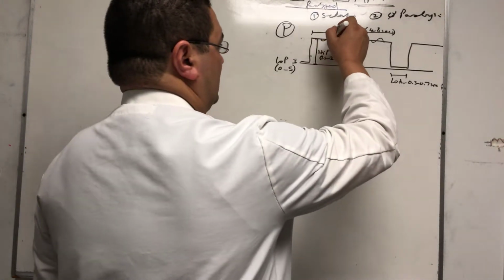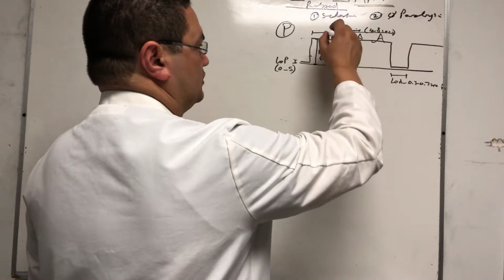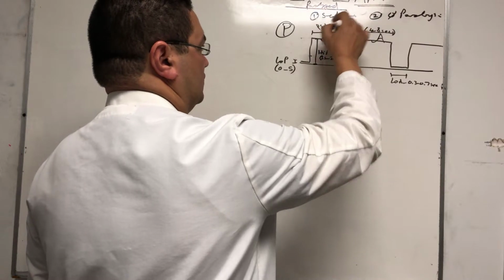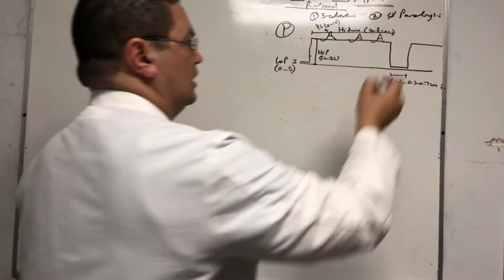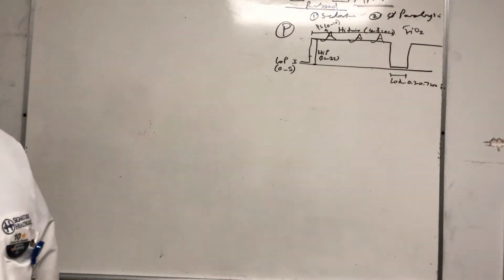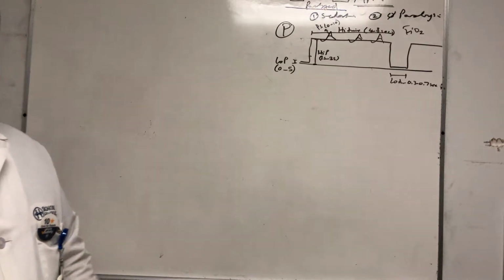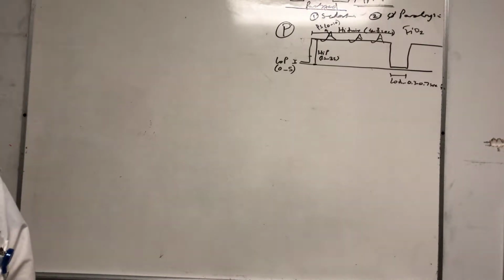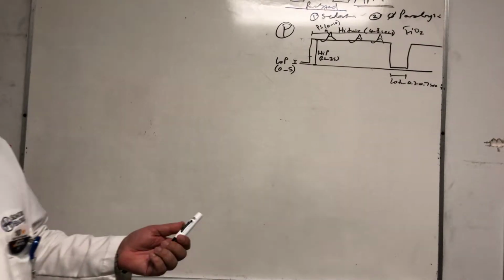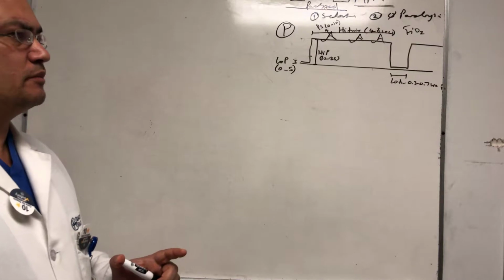In addition to that, you can actually do pressure support. Each one of those small breaths, you can support with a pressure support breath, which is 0 to 10 usually. That's how we start. And then you add the FiO2 to the mix, and that means you have 6 set parameters. Remember yesterday we said you have 4 set parameters for volume control, 5 set parameters for pressure control and SIMV, and 6 set parameters for APRV and bi-level. So that's your set parameters.